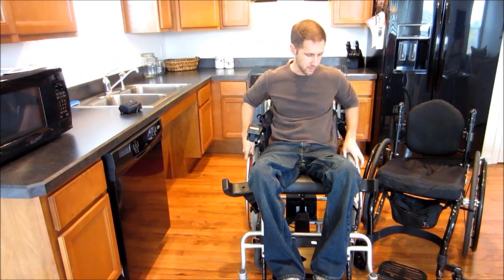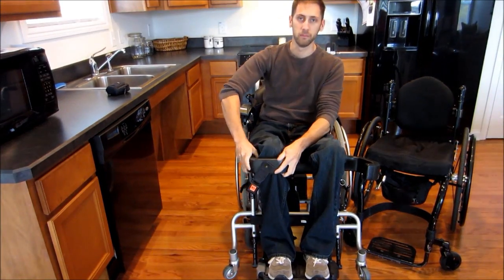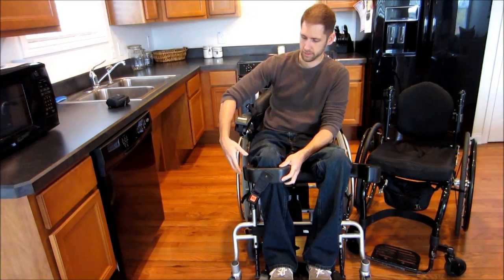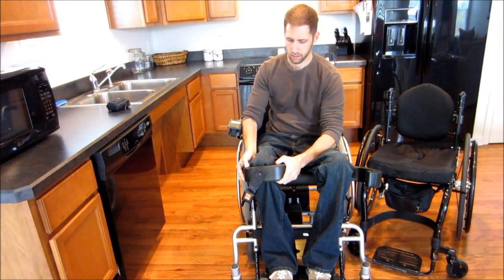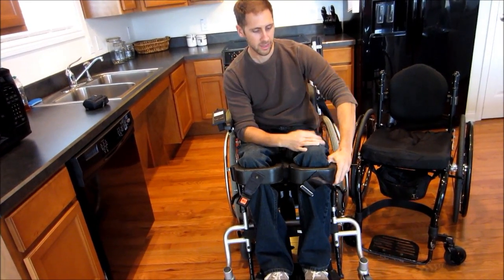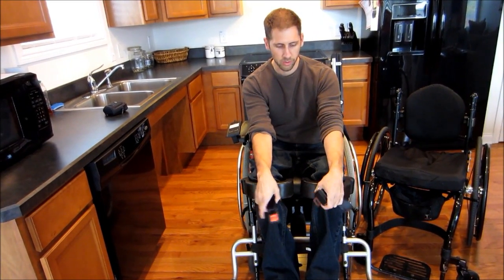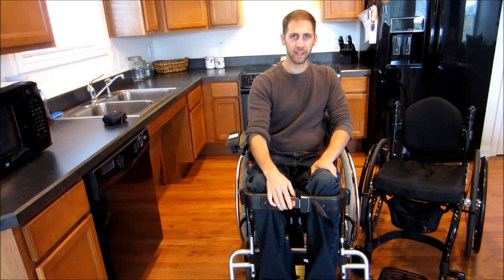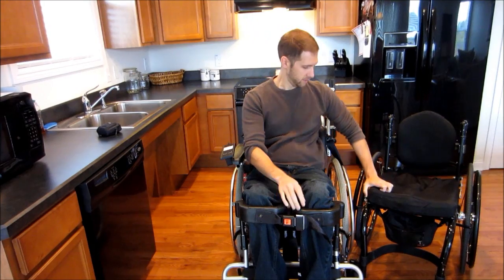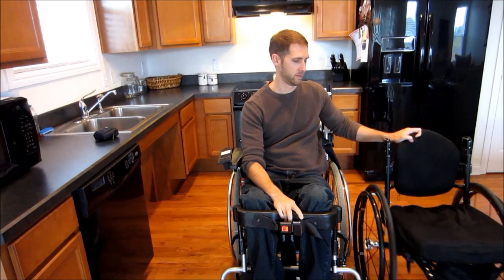So then what this has is these little things that go in front of your knees. That way when you stand up, obviously you want to keep your knees locked in place. So I lock these two things, and then they buckle together. Again, not nearly as nice as that Levo wheelchair that I tried, but hey, for what I could afford, it's what I could afford, and it's going to work for me.